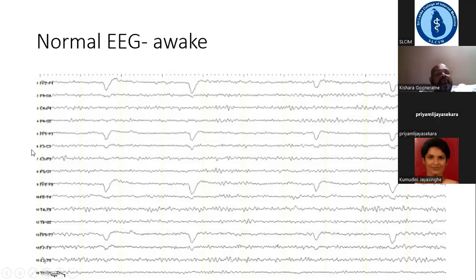And you can see the left hemisphere is the same configuration, and there is low amplitude fast activity or beta activity observed again in the anterior leads, which is FP1 and F3, and then we've got greater amplitude but slower activity, which is alpha range activity, posteriorly, right?